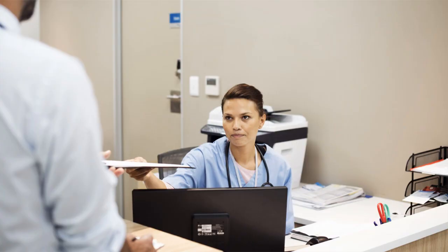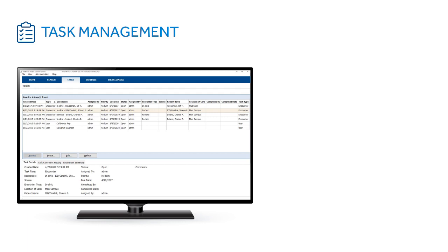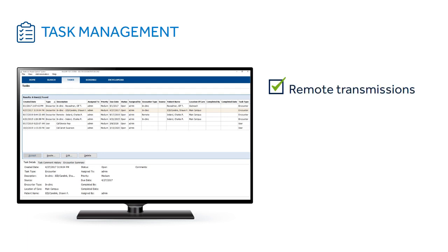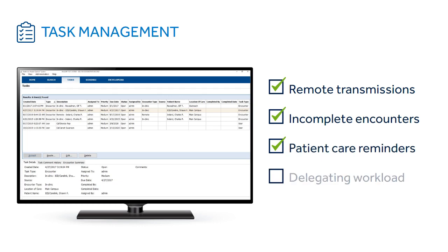Simply select the one you want, and the specific details are filled in for you. Manage a hectic clinic environment with PaceArt's task management feature, which keeps track of work items such as remote transmissions yet to be reviewed, incomplete encounters, patient care reminders, and delegating workload across your team members.